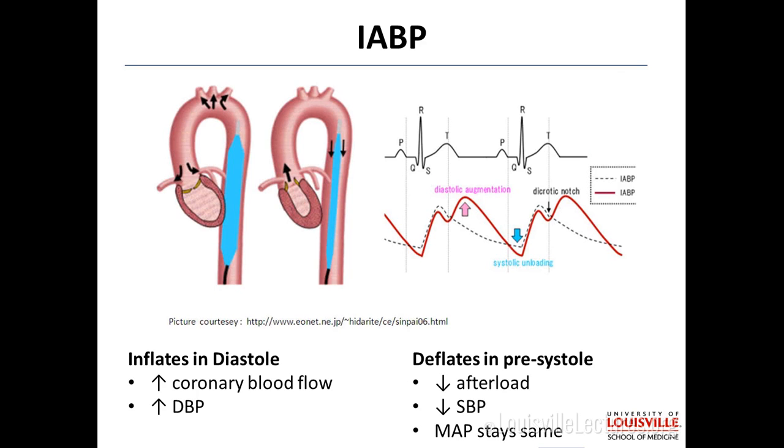A groin check, yep, and make sure they're not bleeding, although there's not much hemolysis with a balloon pump. How do you know where the balloon pump is? Chest x-ray. You want to see at the top of the balloon pump there's a little radio-opaque marker, and it should be basically at the same level as the carina, which is going to be just before the aortic arch. So you want the balloon pump tip here.